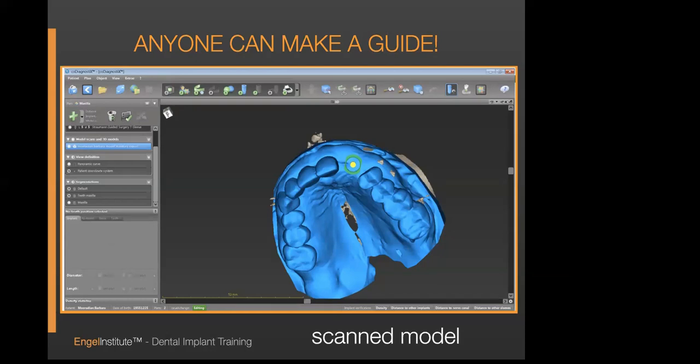So in this case, a patient comes to me, she's missing 9 and 10 for a long time, and everything shifted forward. And I've got pretty good room for implants, but if you notice, the contact to contact is very small. So an average lateral incisor mesial distal is about 7 millimeters. The average canine is probably 7, 8, 9 millimeters, depending on the size of the person. So we could need anywhere from 13 on the small end of millimeters all the way to about 17 millimeters of space, 15 millimeters of space for teeth, because I think teeth first. My problem is I had just a little over 11.